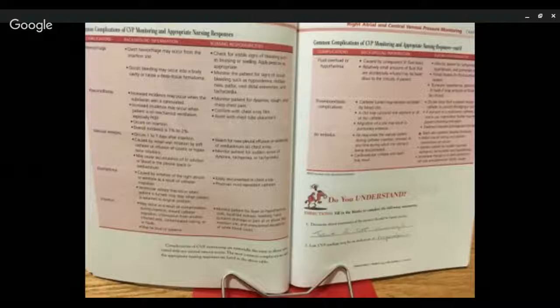Other complication that is common with CVP monitoring is vascular erosions. They occur days after insertion. It's caused by vessel wall irritation, by a stiff catheter, or infusion of hypertonic solutions. May cause accumulation of IV solution or blood in the pleural space or mediastinum. Appropriate response for vascular erosions is to watch for new pleural effusions or widening of the mediastinum on chest X-ray.